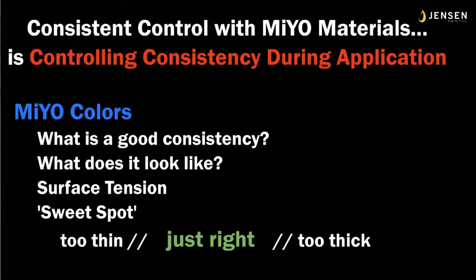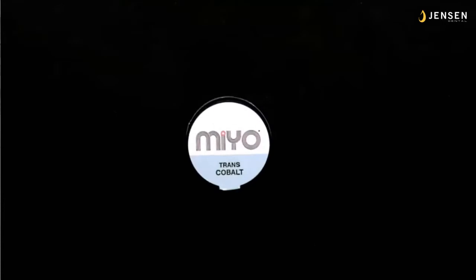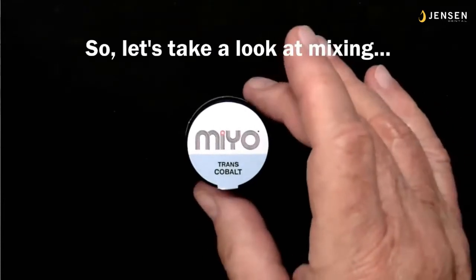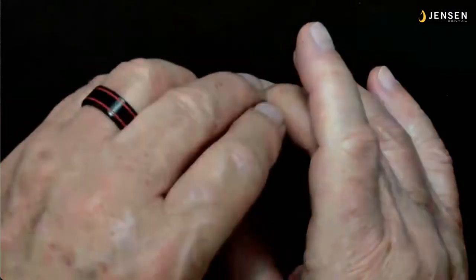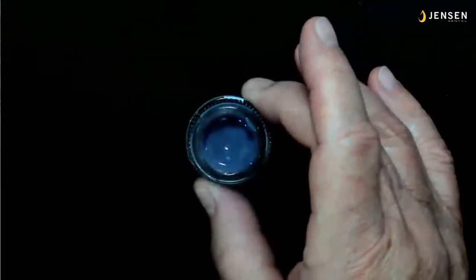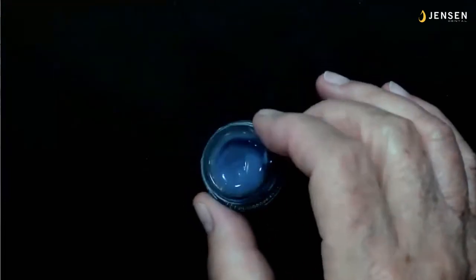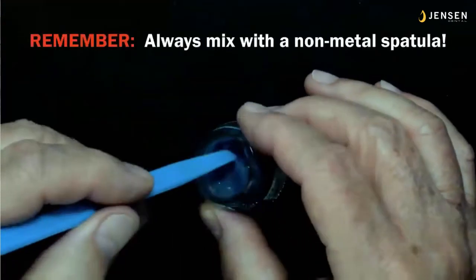It's a sweet spot. You don't want it too thin, where it's watery or loose like a liquid, and you don't want it pasty. You want the sweet spot somewhere in between. But ideally, for most of our application, what we want is that sweet spot where it can be applied with a brush, but closer towards the thick than the thin.